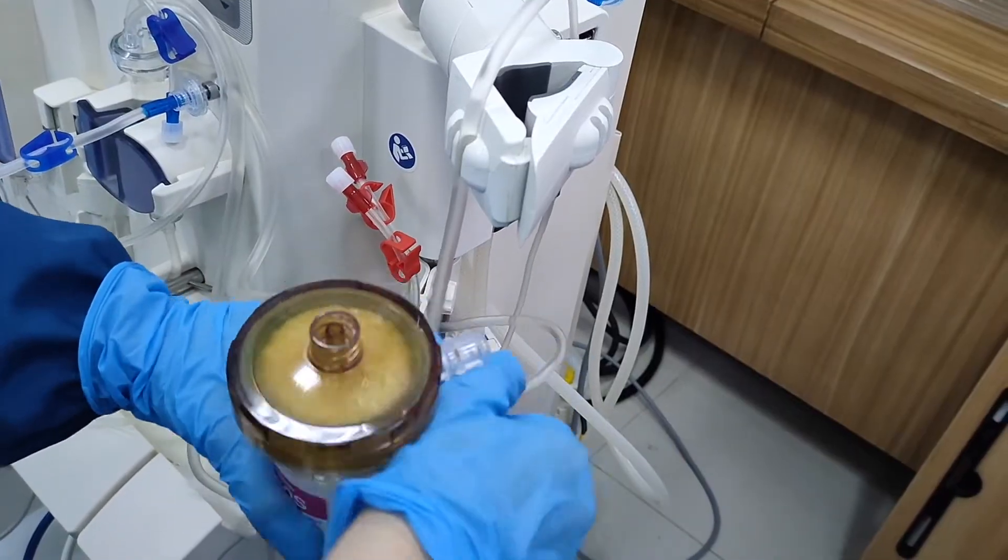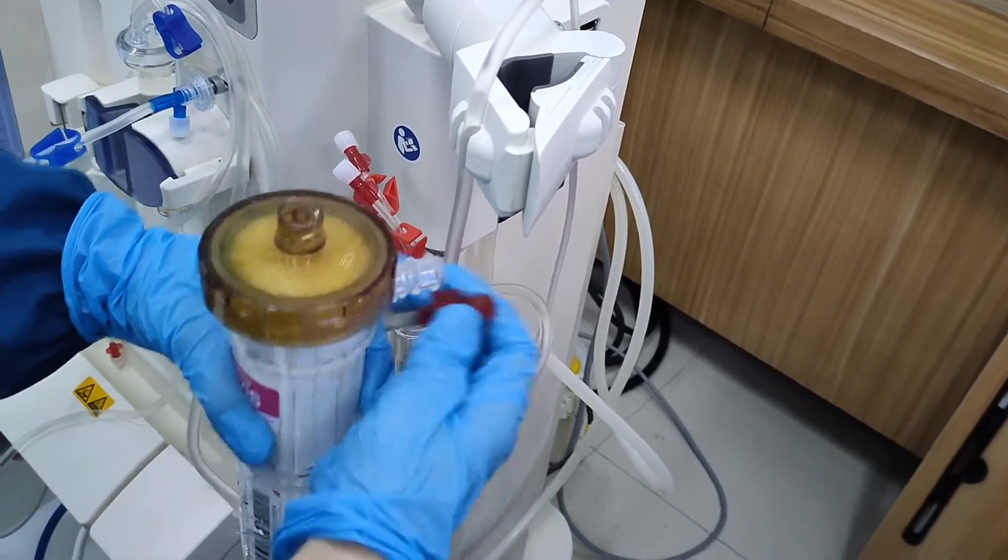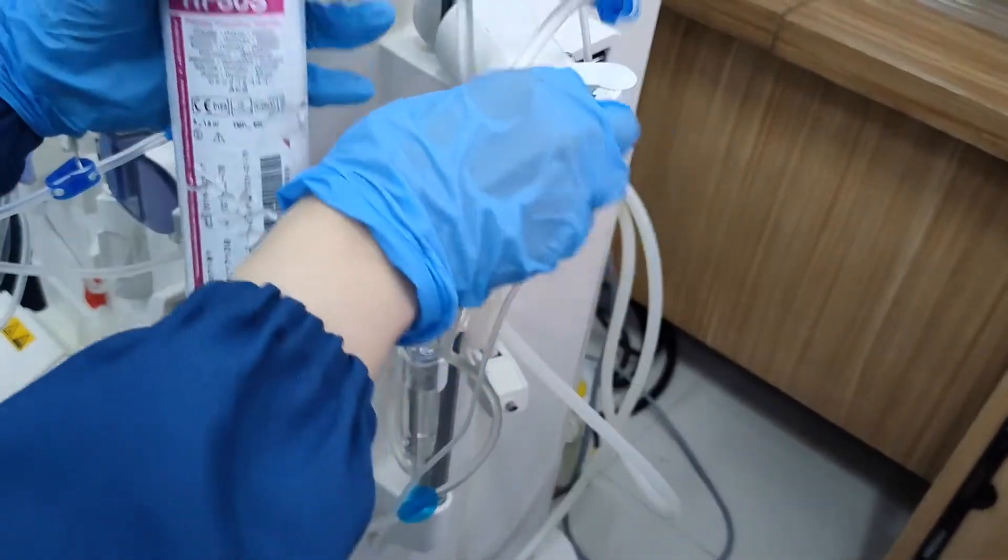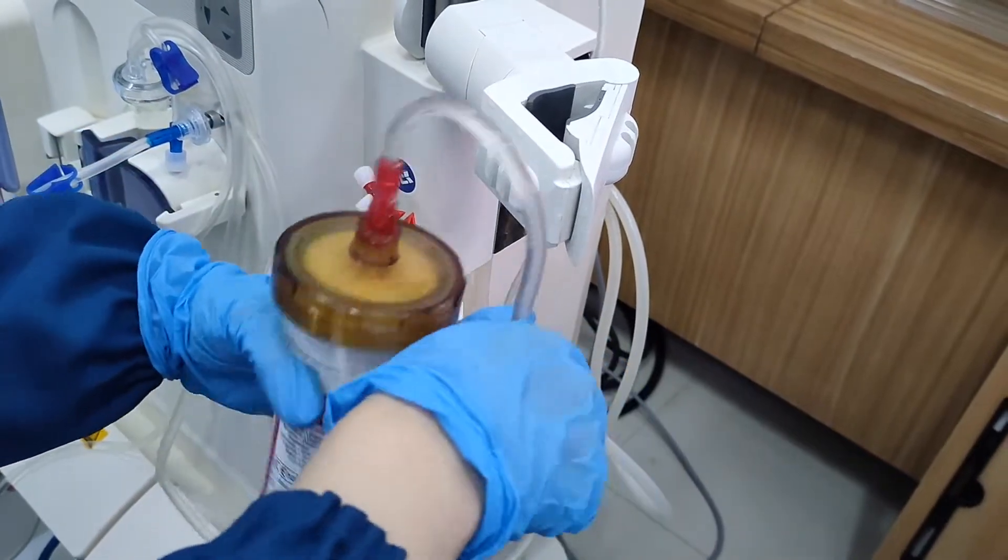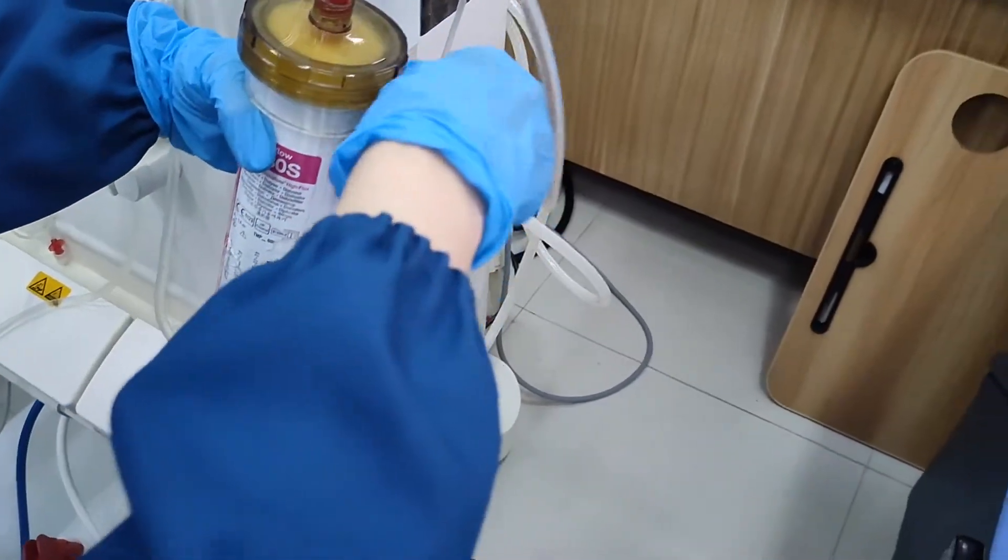Then, take the arterial dialyzer port and connect it on top of the dialyzer. Do the same and connect the venous dialyzer port at the bottom of the dialyzer.